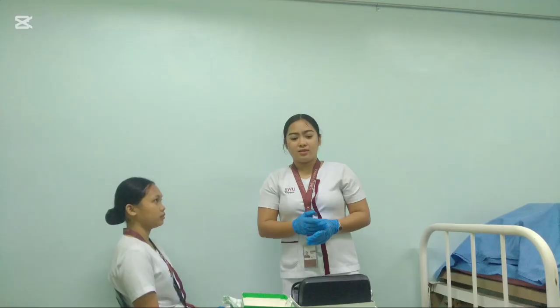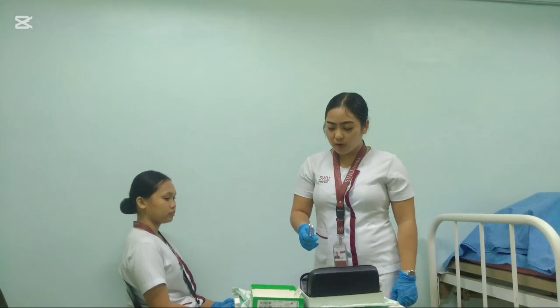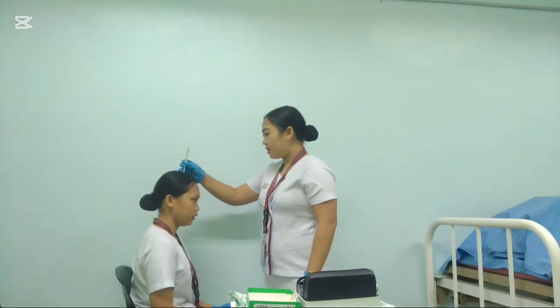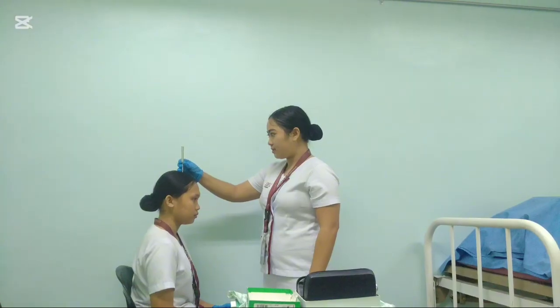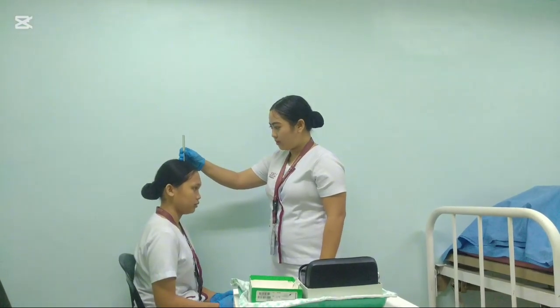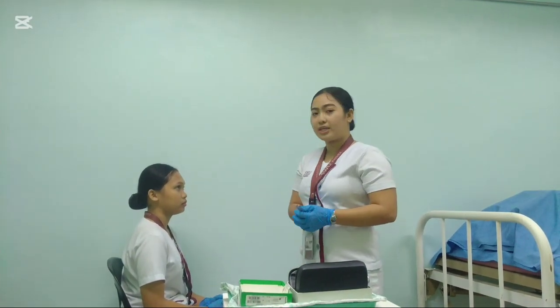Next is to use the tuning fork to perform the Weber's test for lateralization by stroking the tuning fork and putting it on the cranium of the patient at the center. Do you feel any lateralization? Okay, so the patient did not feel any lateralization, so therefore she is normal.